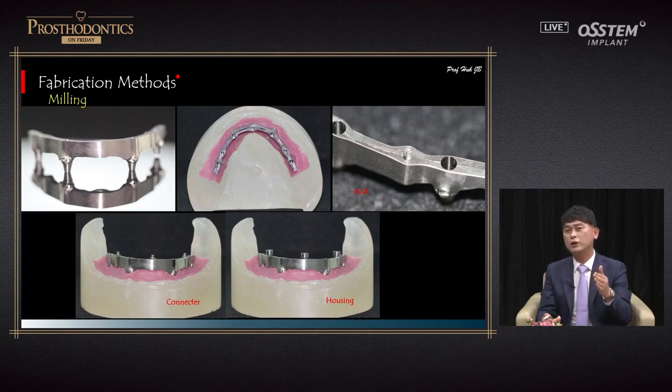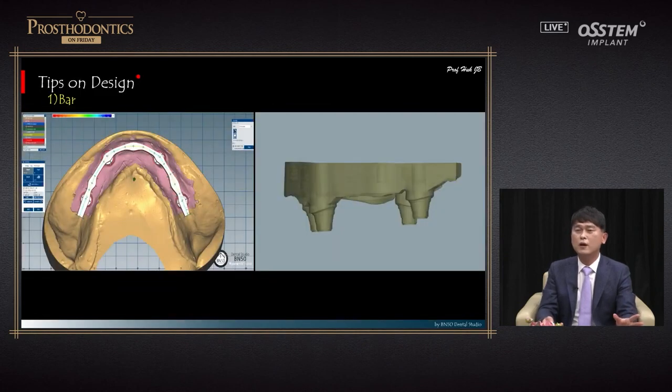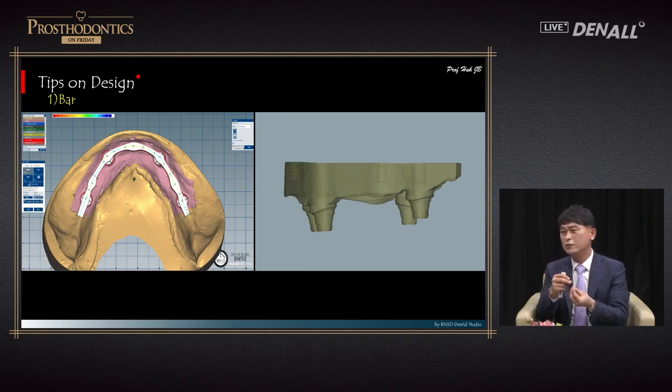If paths are not aligned, you need to use the multi-abutments, which is available from Osstem too. All of them, including the abutment and connection part, can be milled as one piece. With the digital technique, it is very good. We don't have to go through the putty index or measuring VD multiple times or milling using the survey. No such complicated jobs are required.